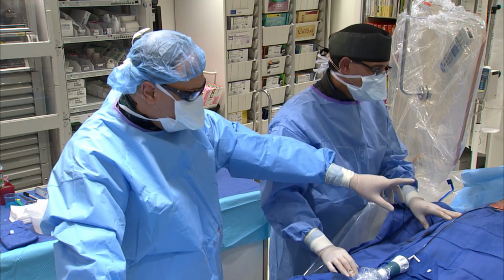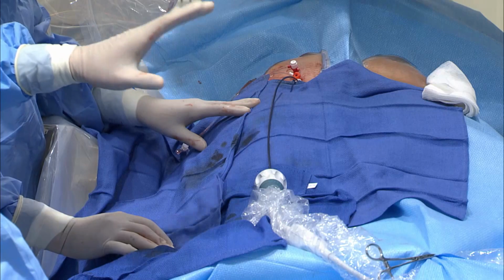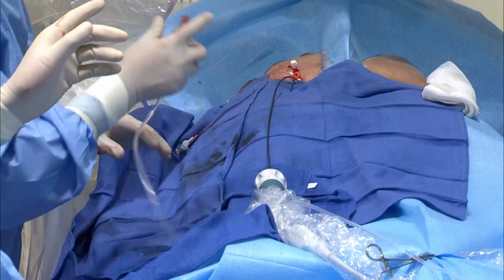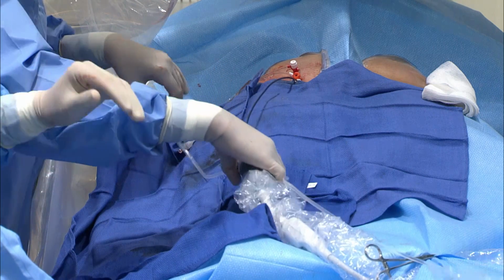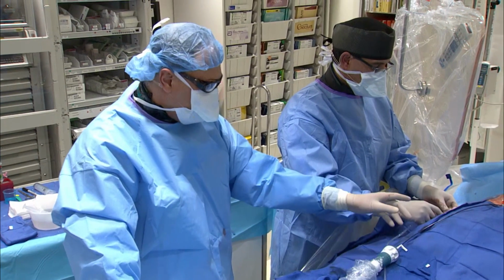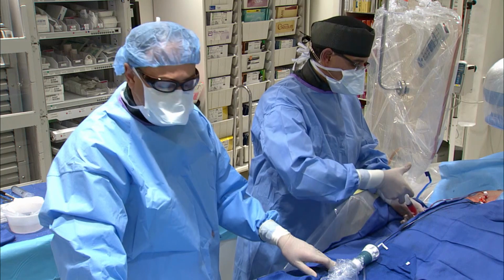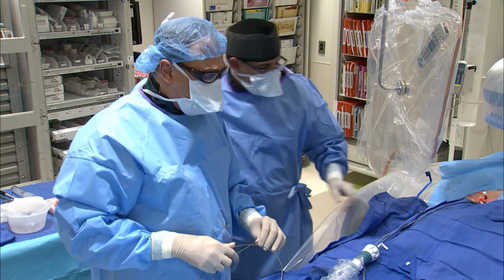Now, what we did here in this case is we have a 4 French arterial sheath. We did a quick coronary angiography to make sure she's 69, to confirm that she did not have any coronary artery disease. And on the right side, in the common femoral vein, just about a centimeter apart, there are 2 venous sheaths. So that's important that we can do 2 venous sheaths on the same side. There is an 8 French long venous sheath for ICE catheter and a 7 French venous sheath that we are going to exchange to put a bigger sheath in. And we did a right heart catheterization. We confirmed what Andreas has just talked about, that she did not have severe pulmonary hypertension and Eisenmenger physiology.